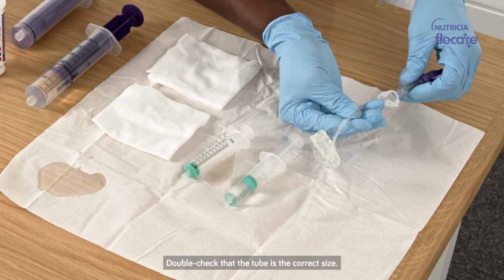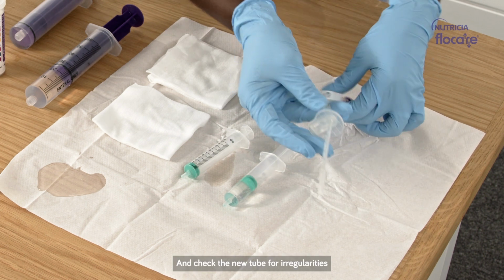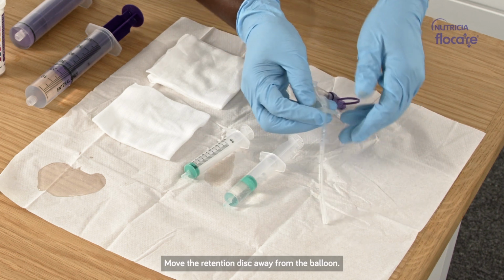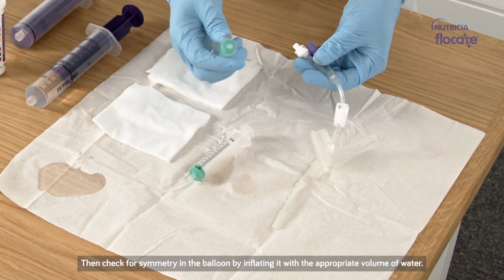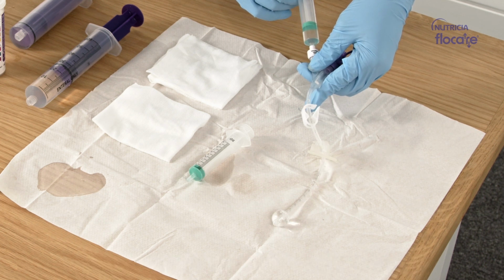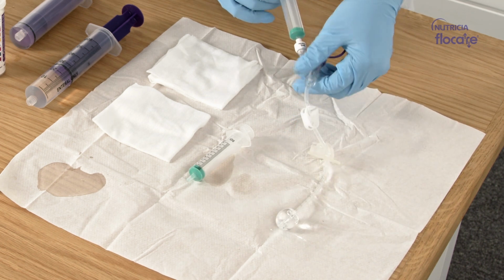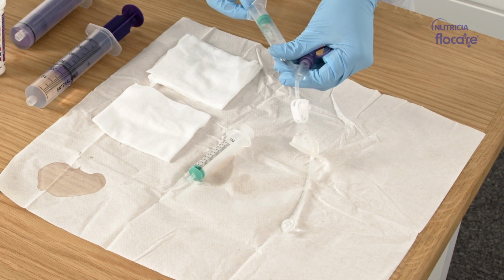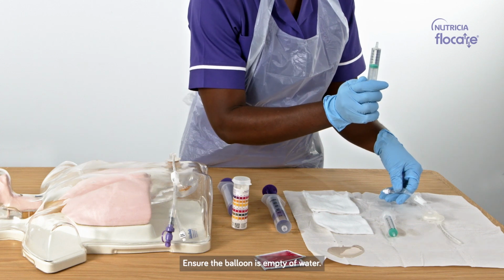Double-check that the tube is the correct size, and check the new tube for irregularities. Move the retention disc away from the balloon. Then check for symmetry in the balloon by inflating it with the appropriate volume of water, and then deflating it again. Ensure the balloon is empty of water.